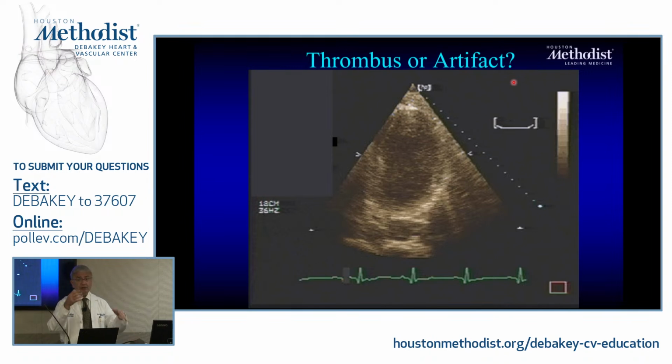And at times you could have mirror imaging because I'm reflecting this circle, let's say the aorta. I could see another aorta down there. Why? Because some of these images are being reflected, and then since they take twice the time, the machine will put the other image below it. So that's mirror imaging. But here in this picture, I see a lot of artifacts. I can't even tell whether there's a thrombus or not. So this could be because obviously either poor penetration from the chest wall or a reverberation back and forth that is crowding the apex itself.